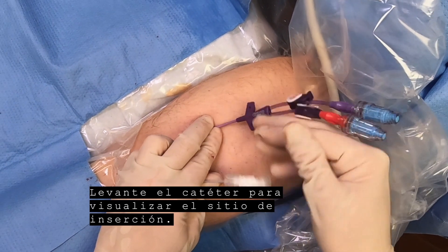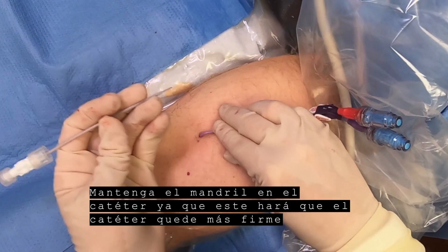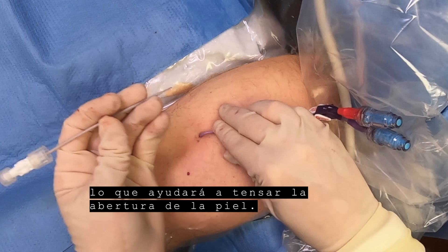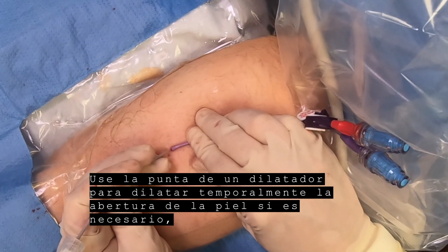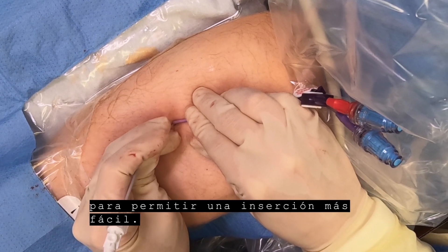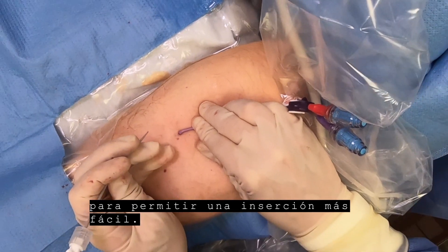Lift the catheter to visualize the insertion site. Keep the stylet or wire in the catheter because it will make the catheter firmer, which will help when stretching the skin opening. Use the tip of a dilator to temporarily dilate the skin opening if necessary to allow easier insertion.